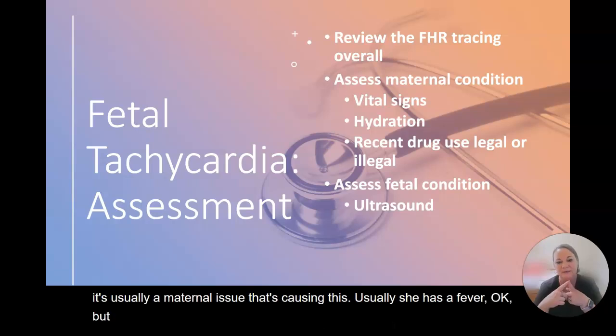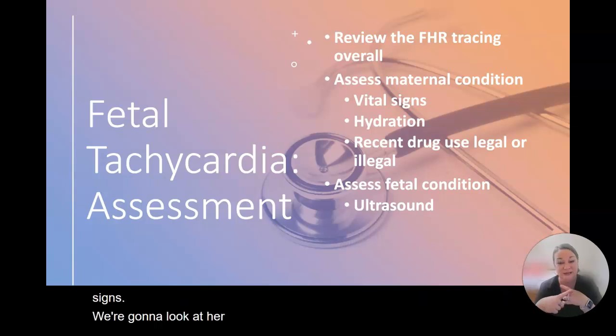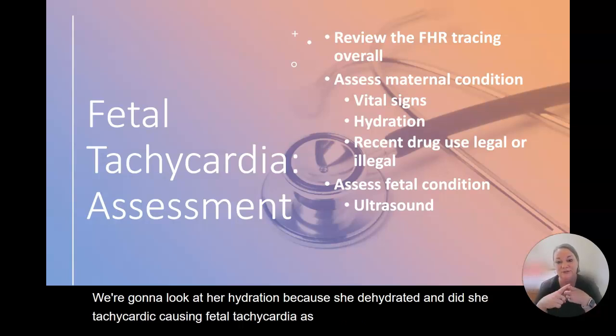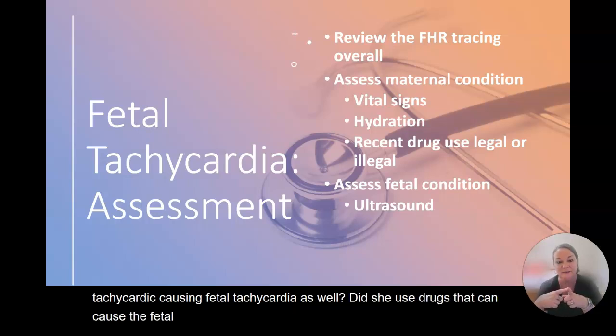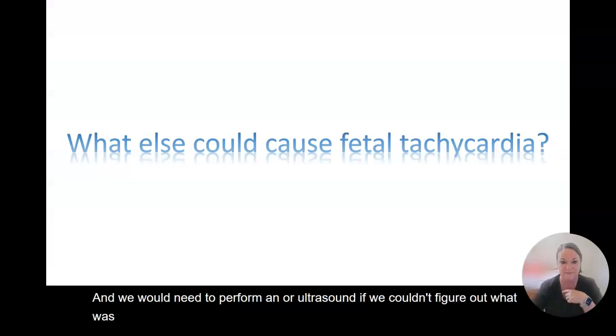But we're going to assess all these other things. We're going to look at her vital signs. We're going to look at her hydration. Is she dehydrated, and is she tachycardic, causing fetal tachycardia as well? Did she use drugs? That can cause the fetal heart rate to increase as well. And we would need to perform an ultrasound if we couldn't figure out what was going on.